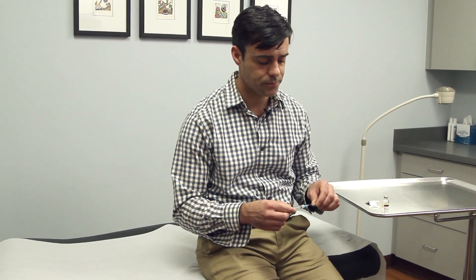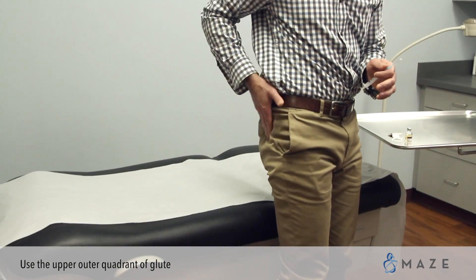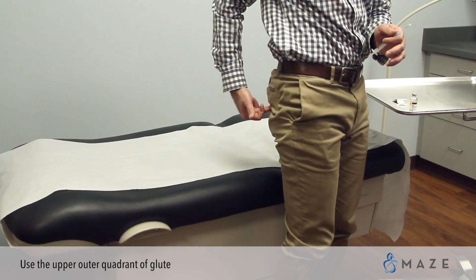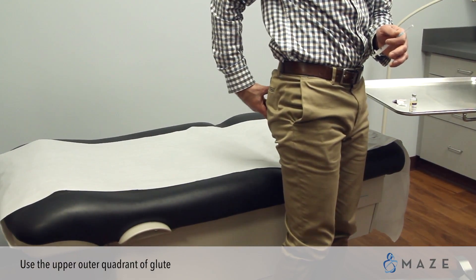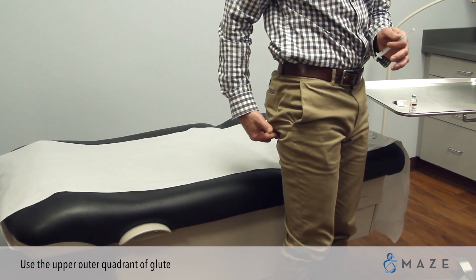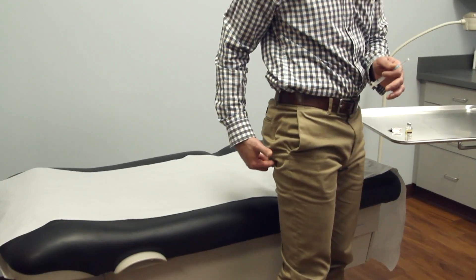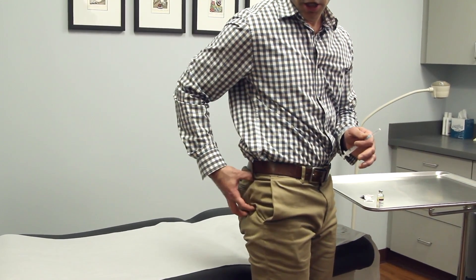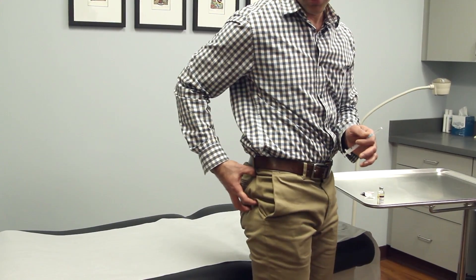To do a gluteal injection you will use the upper outer quadrant of the butt. If you divide the cheek into four quadrants, you don't do anything on the middle two or the bottom half of the glute — there are nerve supply and blood supply going through those areas.